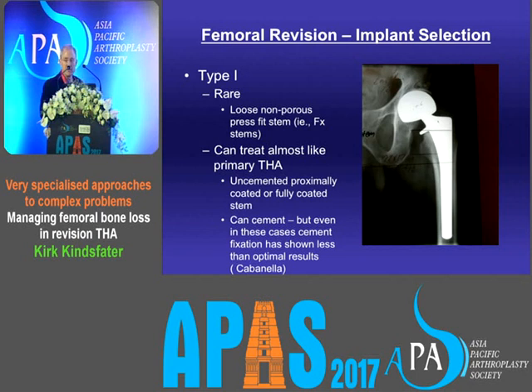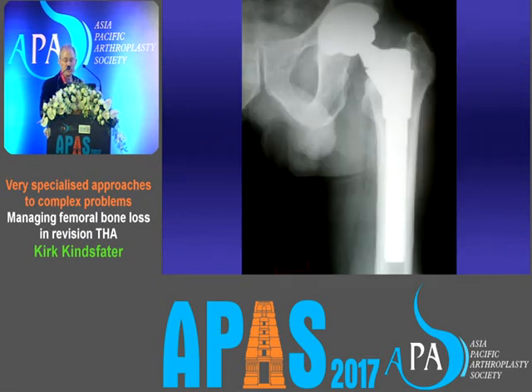But even these have a sclerotic endosteum, so if you're going to cement on these, I think you need to get rid of that. You take a burr and get rid of a lot of that sclerotic bone so you can get some cement interdigitation. I just used an SROM. I was aggressive with the reamer proximally. That's basically a primary hip.